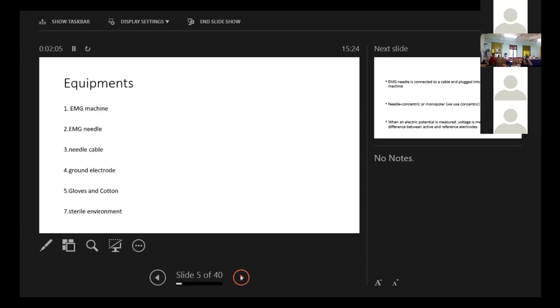The equipments that we use is EMG machine, a needle, a needle cable, a ground electrode, gloves and cotton and obviously a sterile environment.